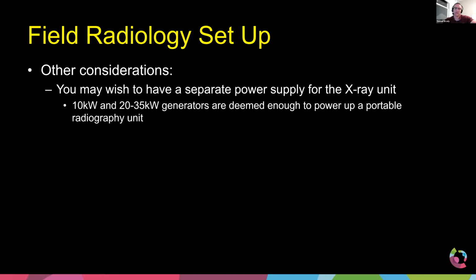That might be a very taxing environment on the power supply. So it might be intermittent. It might have spikes and peaks and valleys. So if you could set up your own power supply, the portable scanner will actually perform better having its batteries fully charged and being able to consistently image.